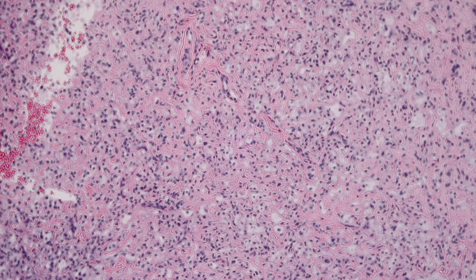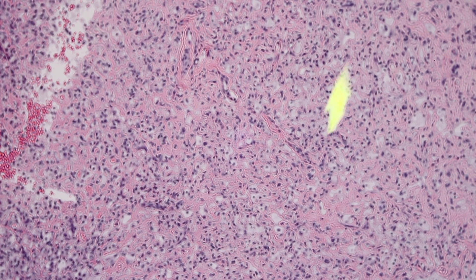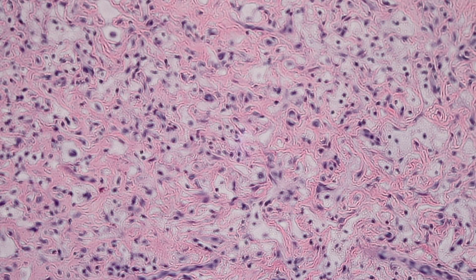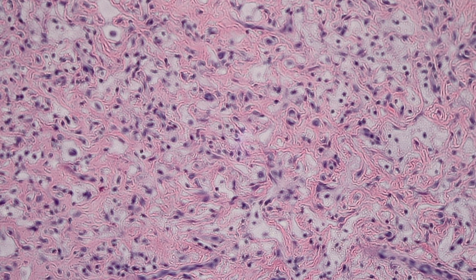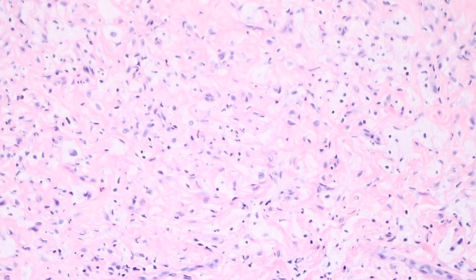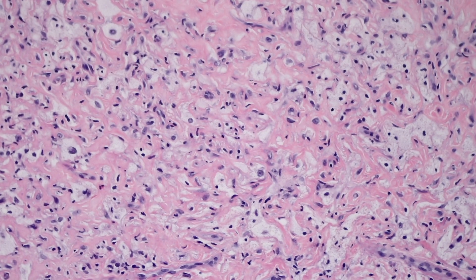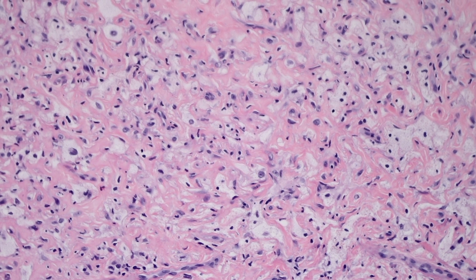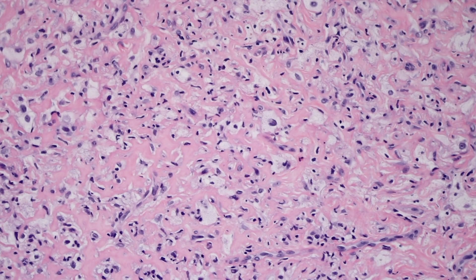I'll flip the condenser and get it out of focus - look at those little arcs and ribbons of dense pink hyalinized collagen. In between those are cells with pale cytoplasm - the foamy xanthomatous cells. You can see it more clearly if you flip the condenser and get out of focus: the rings and arcs of pink collagen. Getting it into focus, you can much better appreciate that in between that really sclerotic collagen we have really abundant foamy cytoplasm in these histiocytoid cells, characteristic of the lipidized type.